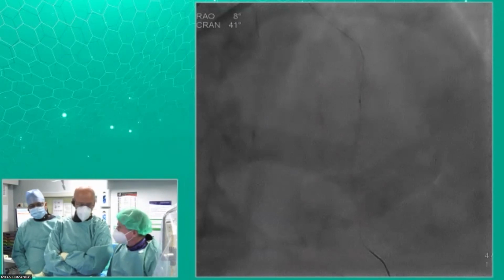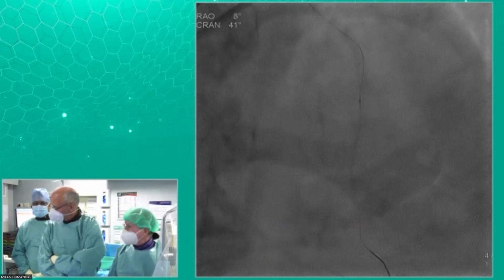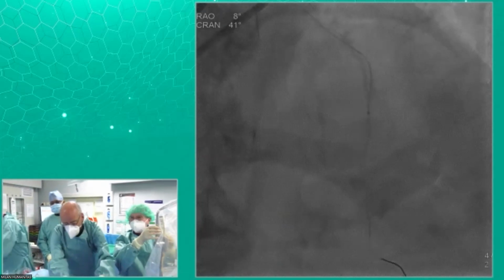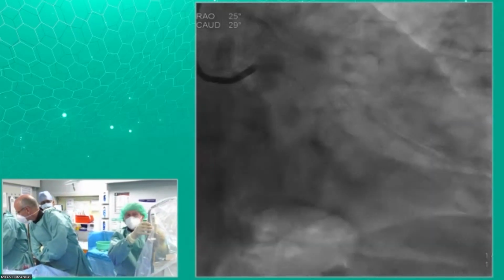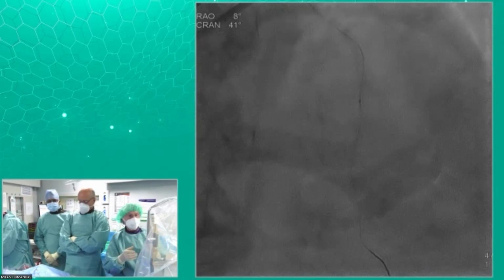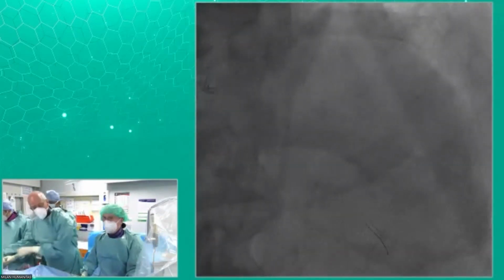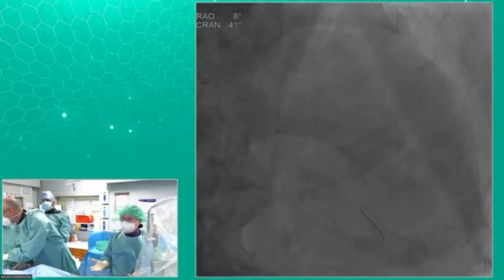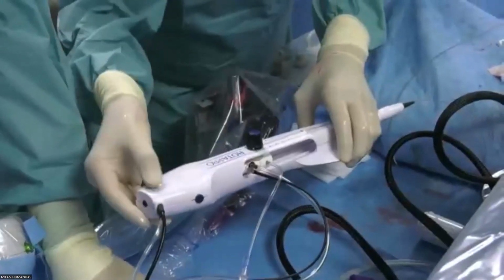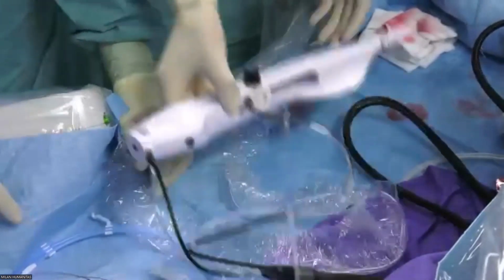So this is a clear sign that there is no time to waste. We are not gonna waste time with IVUS or with a 1.5 or 1.25 balloon. We went as distal as possible with a Fine Cross, and then we switched to a Rota wire. The Rota wire was not so difficult to get distally, and now we have a Rota wire distal. We removed the Fine Cross, and we're gonna do 1.5 rotational atherectomy. I think when the Fine Cross has difficulty to go distally, there's no time to waste. I don't use a 1.0 balloon or stuff like that. I just go with the Rota wire and do rotational atherectomy.